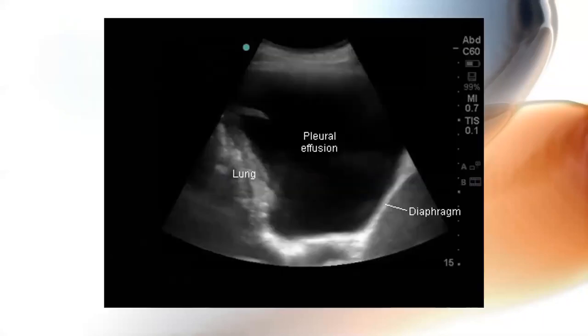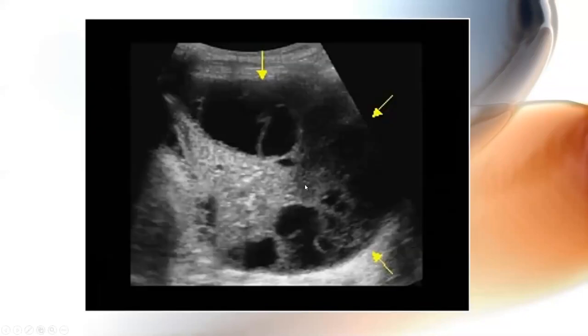So, simple or complicated? Everybody would say resounding. Simple, you can't type that fast, it's cool. Resounding, not simple, looks like broccoli. Sorry, that's not a sea creature. Octopus having a baby, it's very complicated, okay? I'm not sure I would touch that with a needle because I'm not really sure what's lung and what's not. This one I would get a CT.